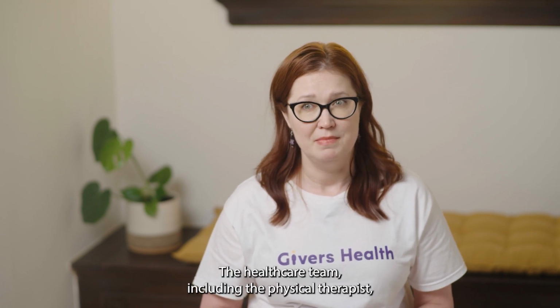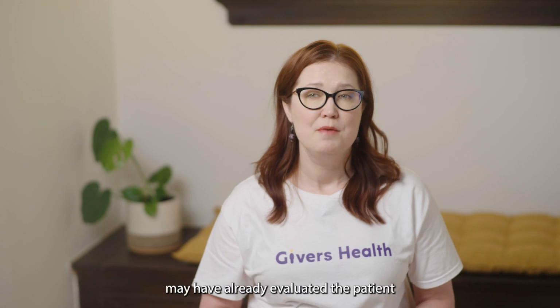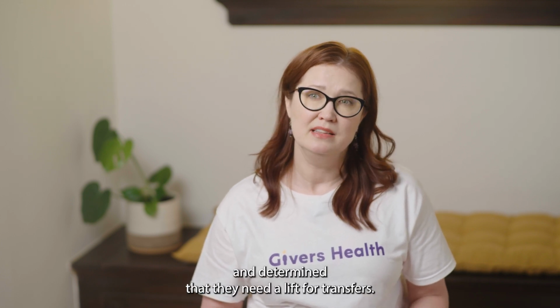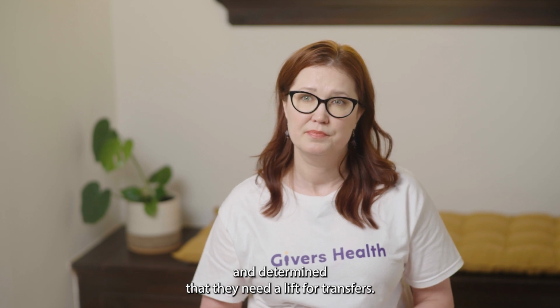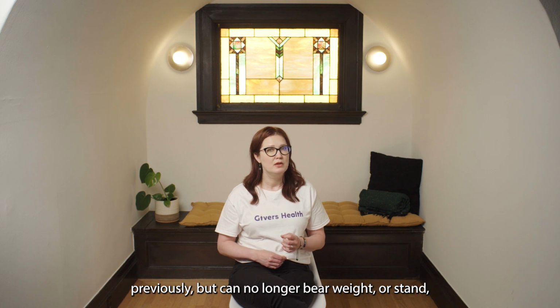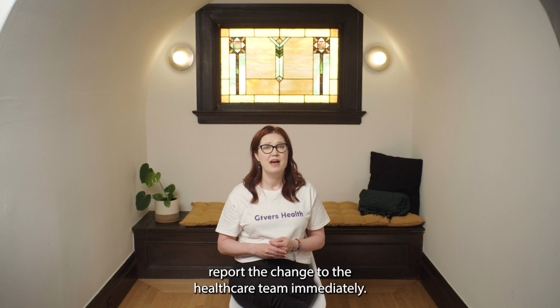The healthcare team, including the physical therapist, may have already evaluated the patient and determined that they need a lift for transfers. If your patient has not needed a lift previously but can no longer bear weight or stand, report the change to the healthcare team immediately.